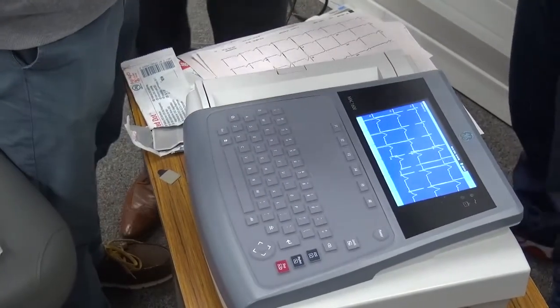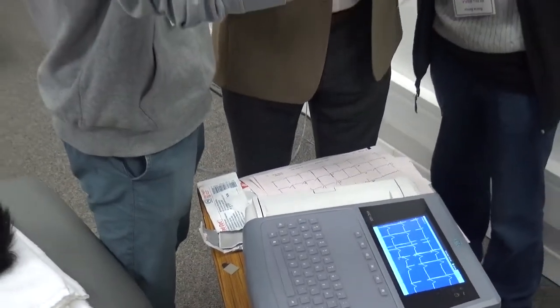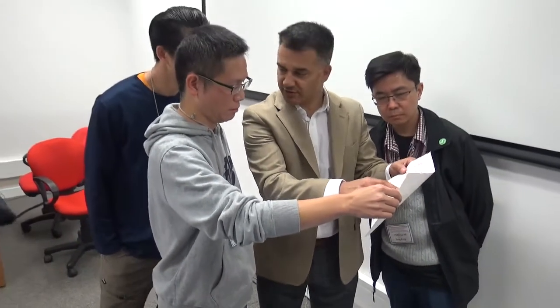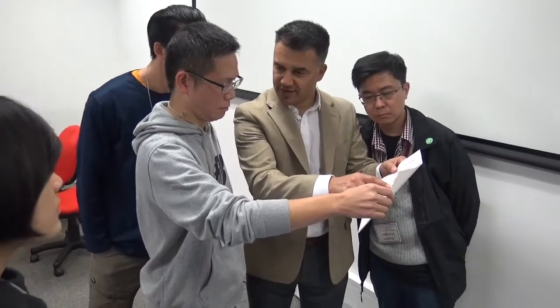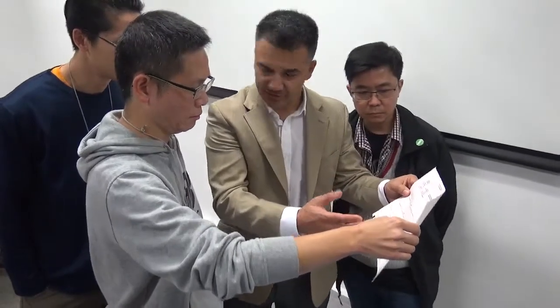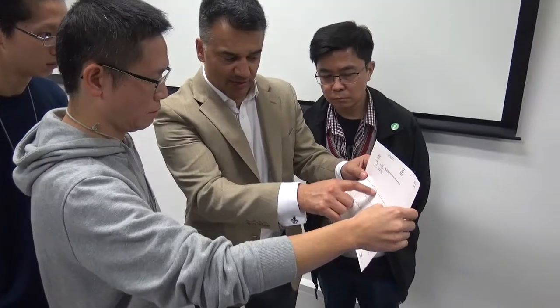So, important things to see. The first thing you do when you look at the ECG is make sure that you haven't got some massive axis change. So I always go to aVR and make sure it's inverted in aVR. If it's inverted in aVR, I'm pretty sure the limb leads are on the right ones. Yeah. Okay? You look for artifact everywhere, there's no artifact. Then you can look at the ECG later. Okay, but the important thing is, have you put it in the right position? Because you've got T-wave inversion in aVR, you've probably got it in the right position. That's what you want to know.